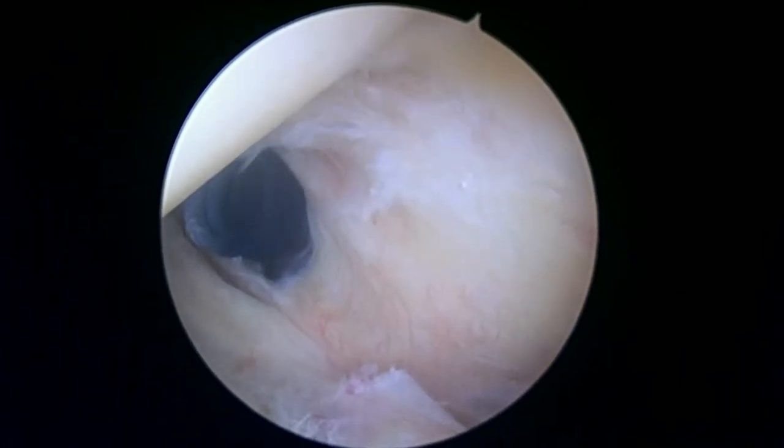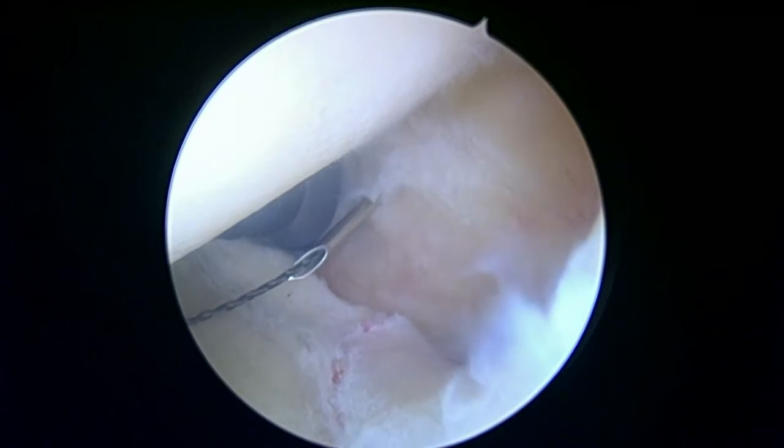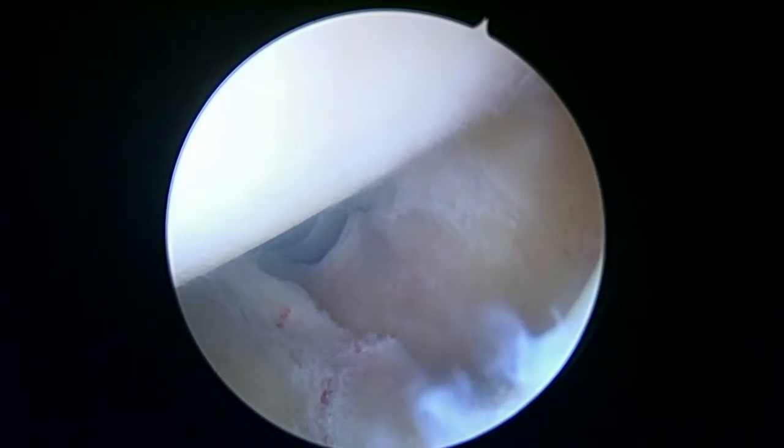We'll show you some more in a minute. Okay, so we're passing this spinal needle across the distal side of the tear here, posterior side of the tear. And then we're going to back out the needle. We're going to pull that through and load that with a suture. This is going to serve two functions. One is it's going to allow us to find this part of the tendon very quickly when we change positions with your shoulder. And the other is it'll function as a suture we can use as part of any repair that we may have to do.